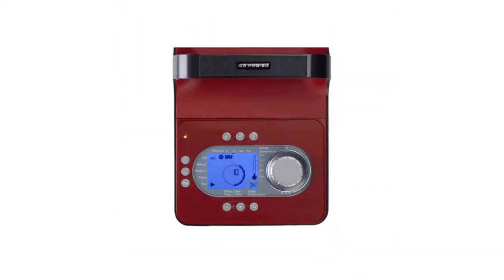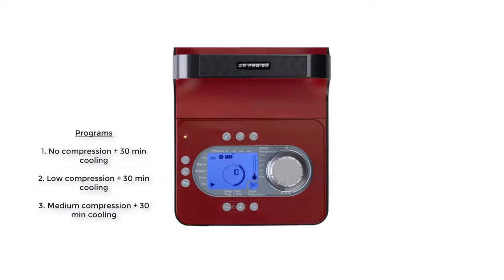Turn on the unit by pressing this button. Select the program — you will only select program one, two, or three. Program one has no compression with 30 minutes of cooling. Program two has low-level compression and 30 minutes of cooling. Program three has medium-level compression and 30 minutes of cooling.